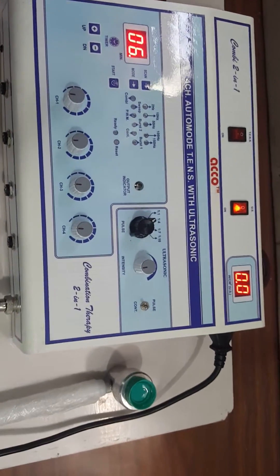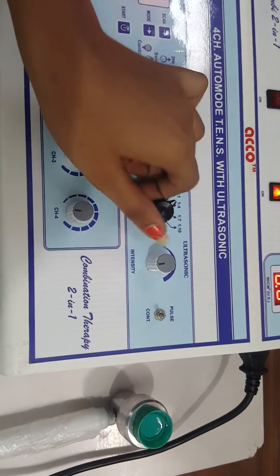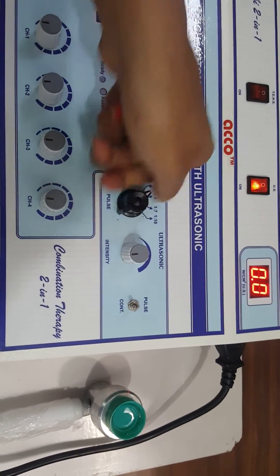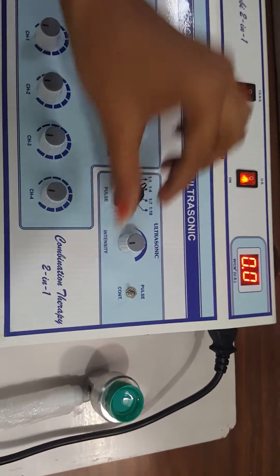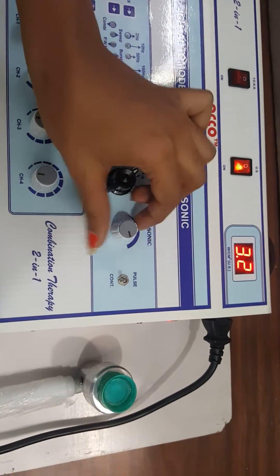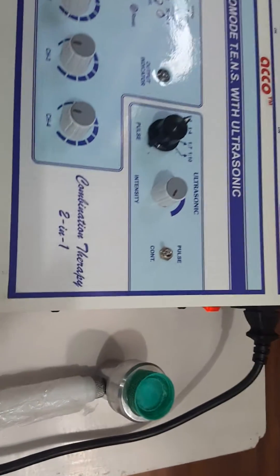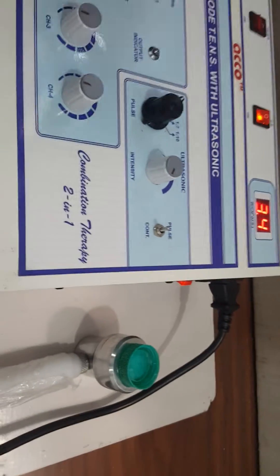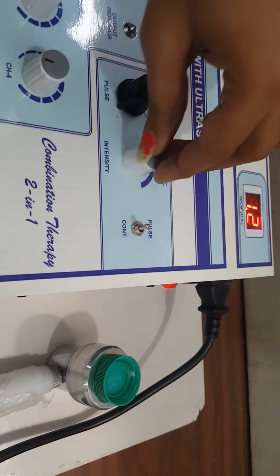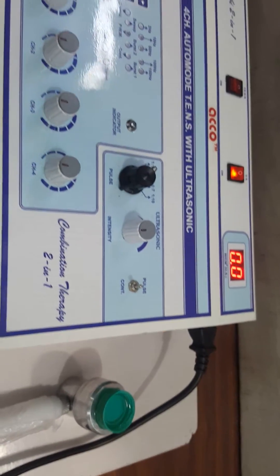Set the mode as per unit — pulse or continuous. You can set the pulse ratio from here, or increase the intensity as per unit. Once the treatment is completed, bring the intensity knob back to zero.